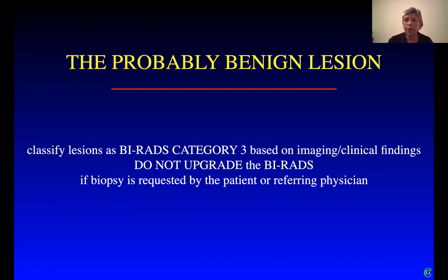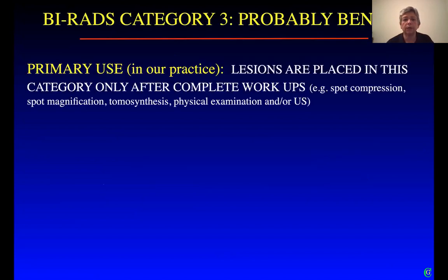So if it's a BI-RADS 3 lesion, I leave it in that category, even though the patient may ask me to do a biopsy. In other words, my recommendation to the patient is a short interval follow-up. I discuss biopsy, and if she elects to have a biopsy, I still leave it as a BI-RADS 3 category.